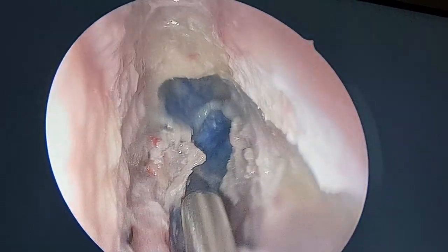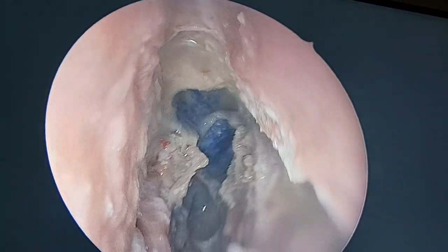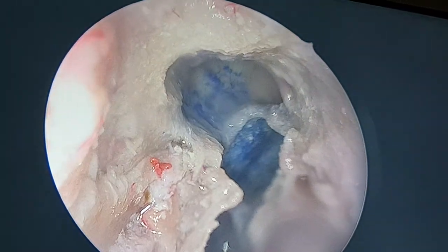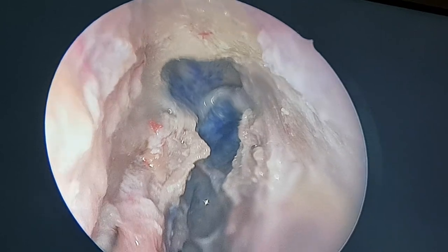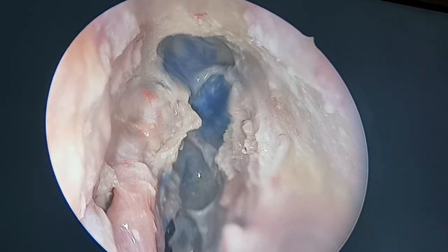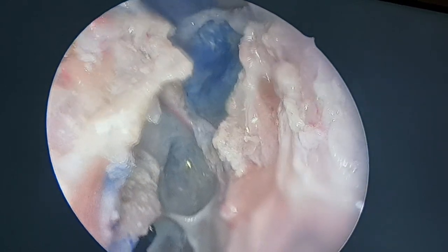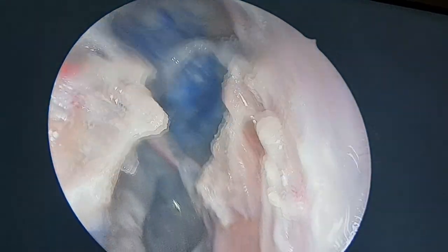You can see the area from outside where I am. See this area. That is the frontal sinus. This is frontal sinus. See the glass illumination. Yes, see the skin. See what you are doing. See there. See the skin. Not harmful. Not at all. Really.